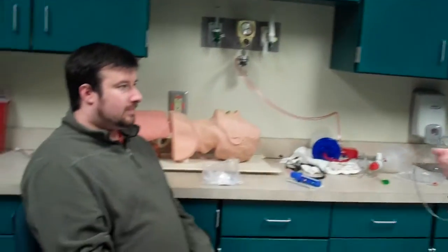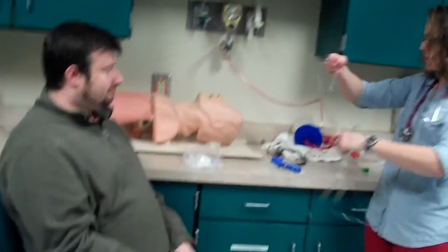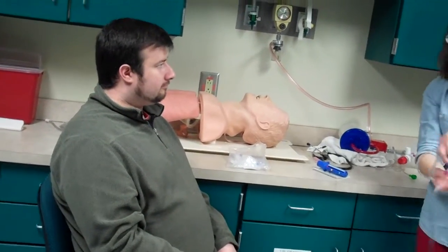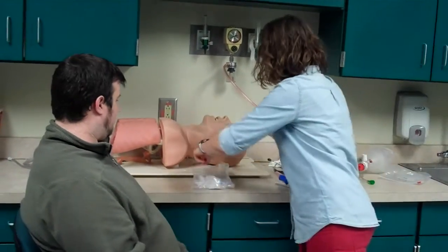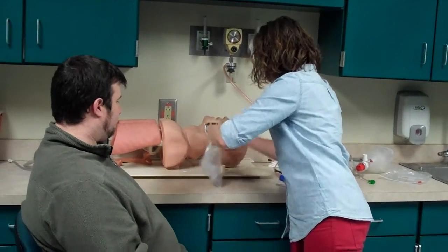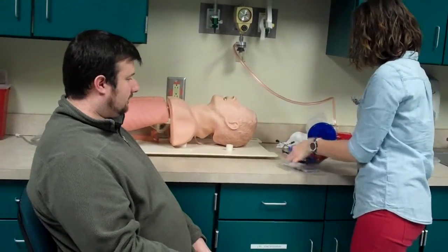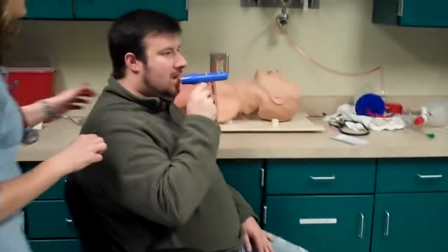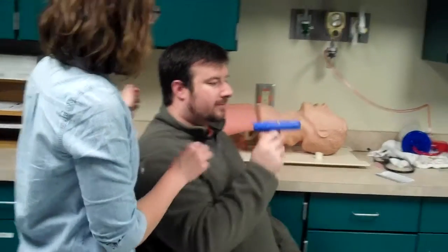Still feeling alright? Yep. No jittery, nothing after the fact? Good, good. That's what I like to hear. We're going to do the peak flow again. I want to see if you got any better. We're going to really do it this time. You're really going to blow into that, alright? Got to take some good deep breaths for it. Ready? And deep, deep, deep, and blow out hard.